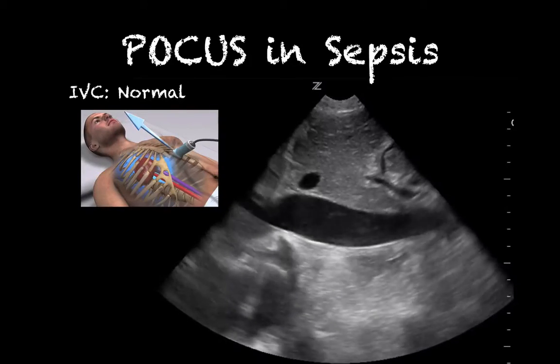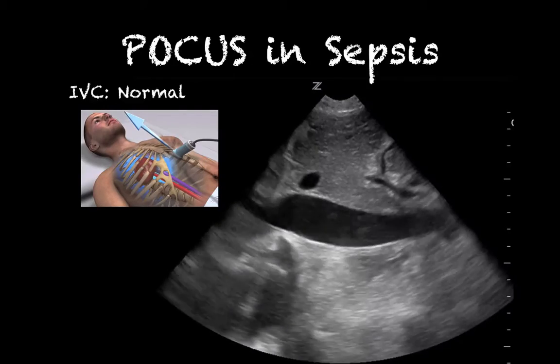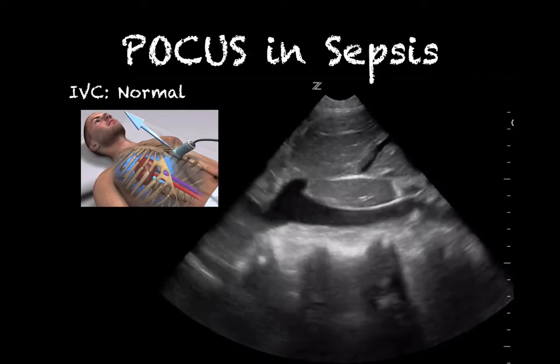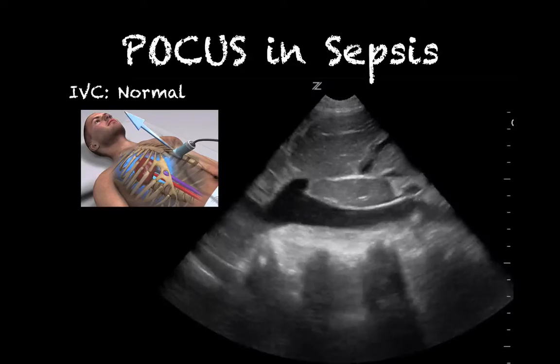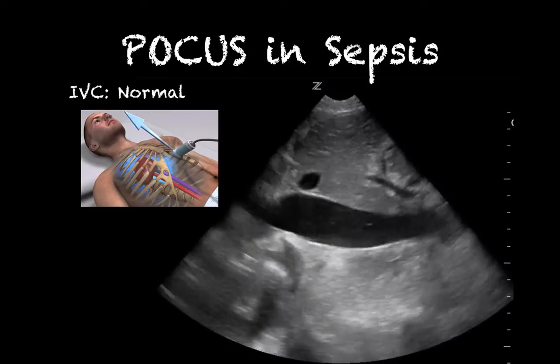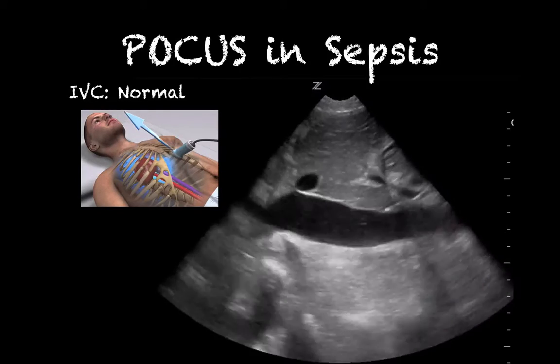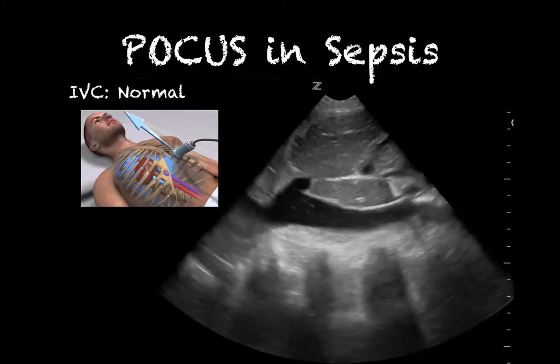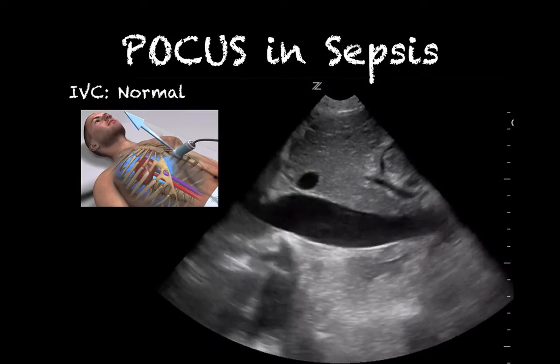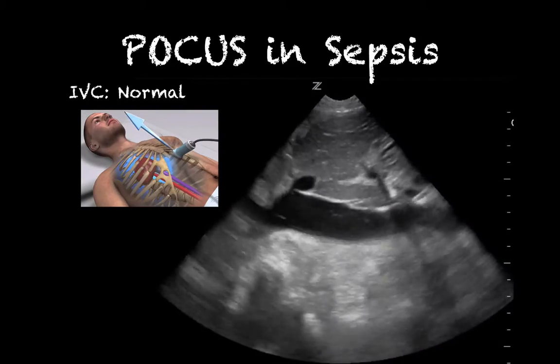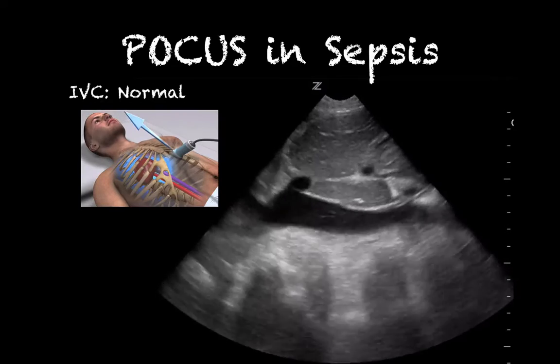The IVC is another good place to look for signs of sepsis or septic shock. We image the IVC in long axis, with the transducer indicator pointed toward the patient's head. You should see the hepatic vein draining into the IVC and the IVC dumping into the right atrium. This is a normal IVC — the width varies somewhat with respiration, but the vessel generally collapses less than 50 percent.